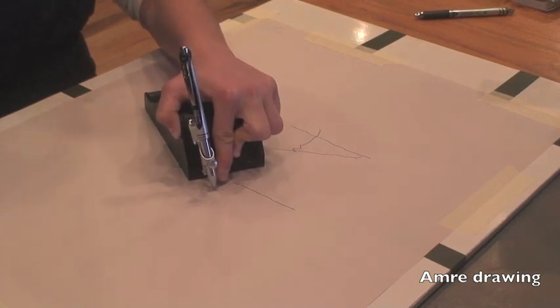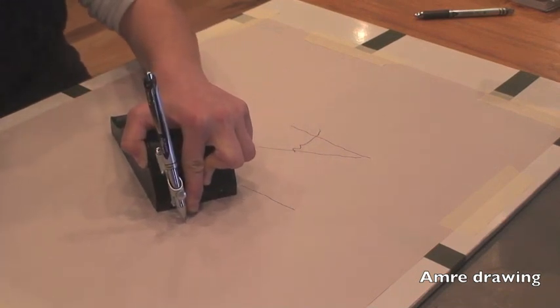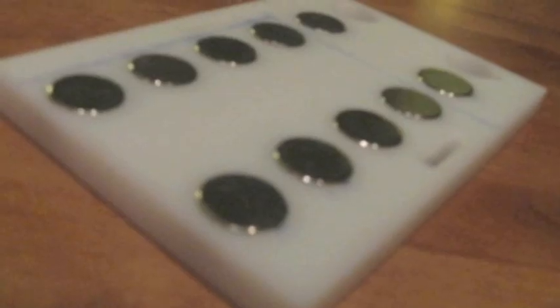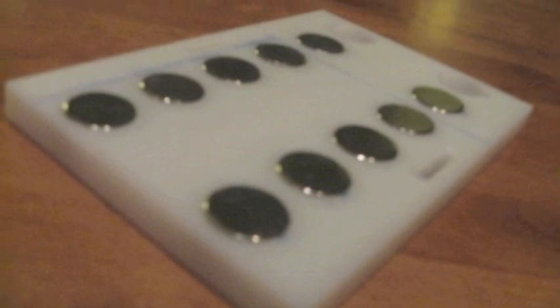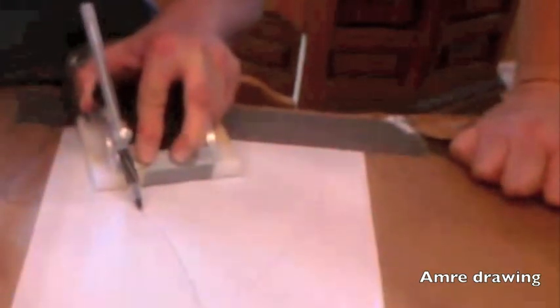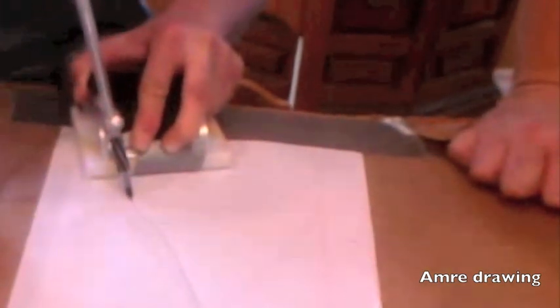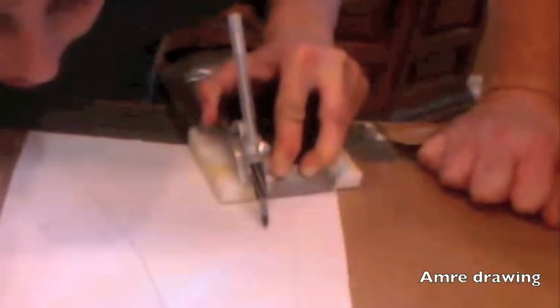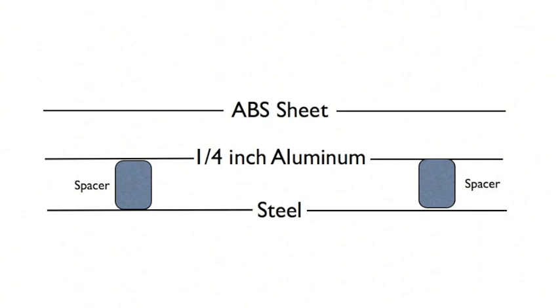This means that deliberate movements Amory makes to draw are not affected, but those caused by her tremor are. For our first prototype using the magnets, we milled a piece of plastic with holes in the bottom. We placed magnets in these holes and attached the pod to see how the two worked together. The device showed dramatic improvement over Amory's freehand drawing, and we knew we were onto something. But of course, our magnetic prototypes would be nothing without the ideal stack of aluminum and steel to create the magnetic damping.